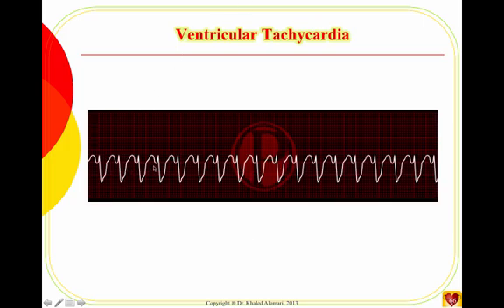With VTAC, you just look at it and you can say right away this is VTAC. Remember when we talked about third degree block — this is the shape of a ventricular contraction. All you see is a regular, wide ventricular contraction. Three PVCs or more will make a VTAC. It's a contraction taking place in the ventricles, completely dissociated from the SA and AV node.